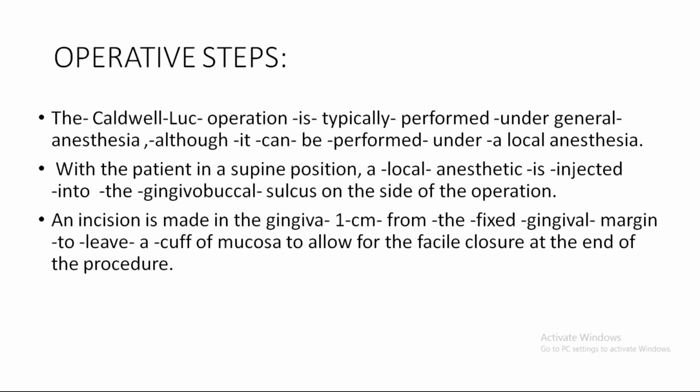Just inject 2% lox in 1 in 2 lakh dilution of adrenaline, and after injecting you wait for 5 minutes, and then an incision is made in the gingiva 1 centimeter from the fixed gingival margin. So why is 1 centimeter taken?